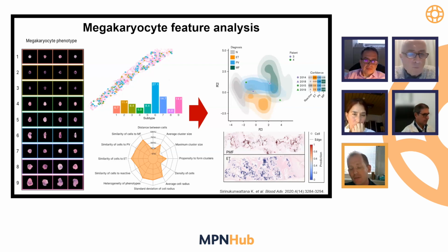When you do this and you plot this disease space, you can then move away from asking simple questions about what's the diagnosis on a new case. I think the question becomes, where do the features sit in the context of all these analyzed samples? And we have here two examples of two patients, one represented by a blue circle and a blue triangle, and one by a green circle and a green triangle.